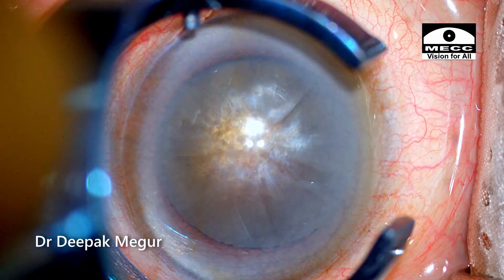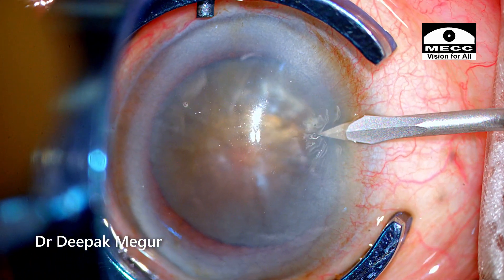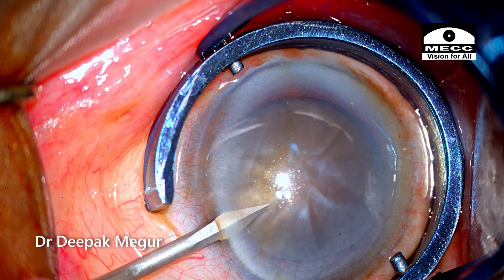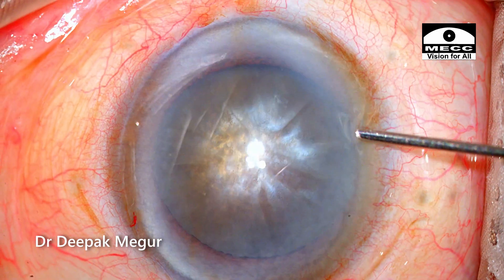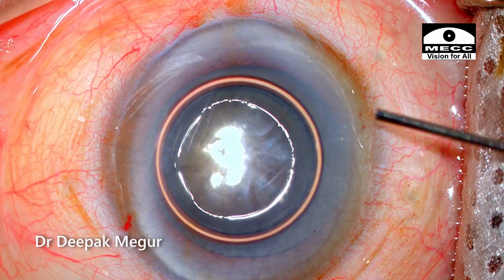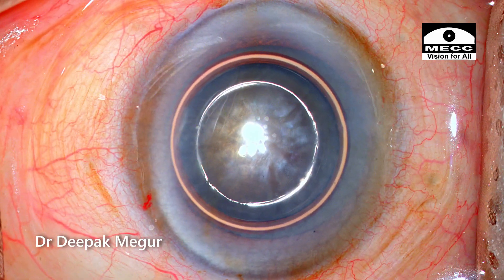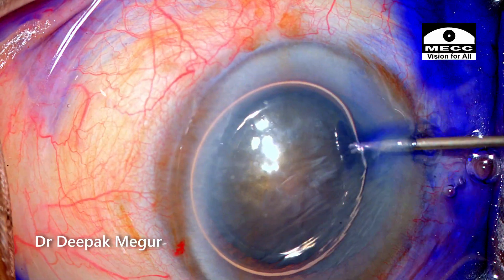Surgery is being done under topical anesthesia. The patient is very cooperative and calm. The globe is stabilized and the side port incisions are created. I always use intracameral preservative-free xylocaine into the eye. The patient usually feels a little bit of stinging sensation as we put in the anesthetic, but later on it really makes the job much easier.